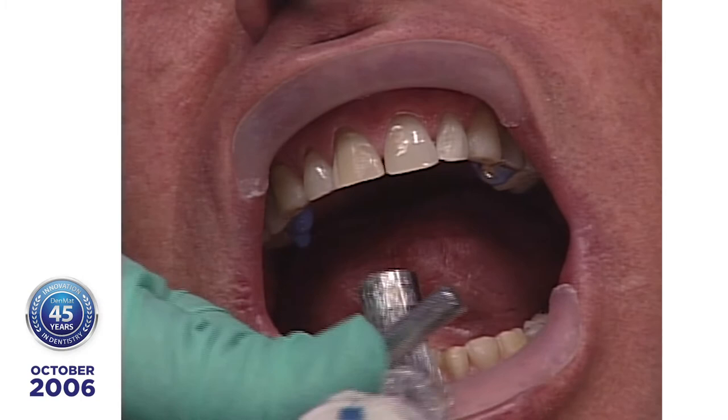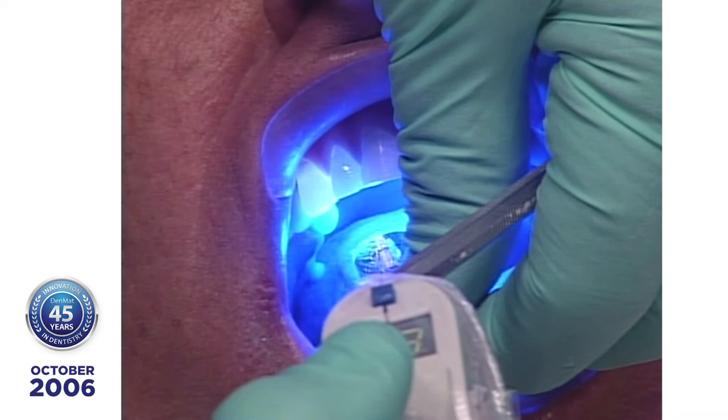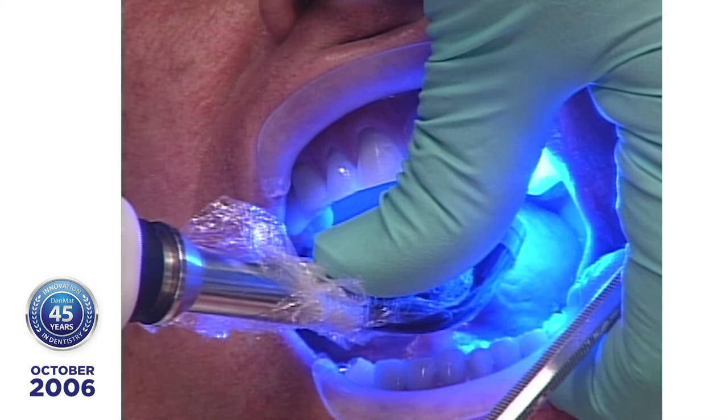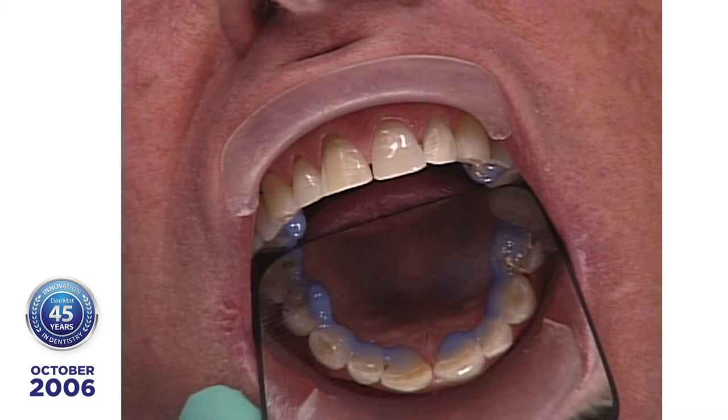Close your eyes. Okay, now we'll take the mirror and I'll show you what this looks like on the lingual side. Just takes a minute and it saves a lot of finishing time.